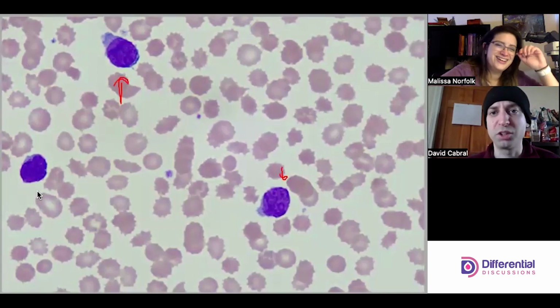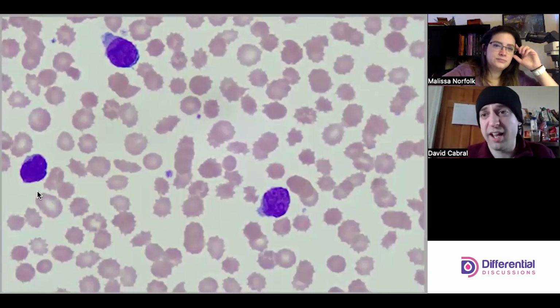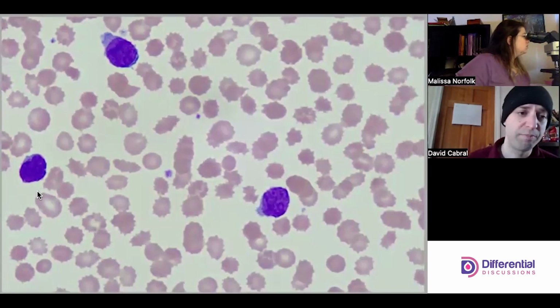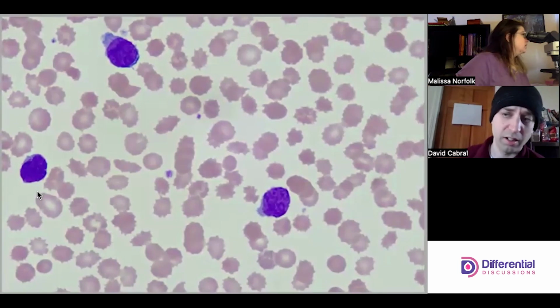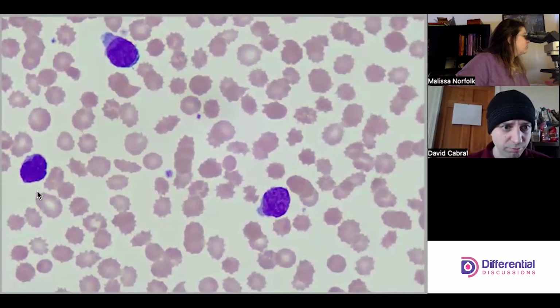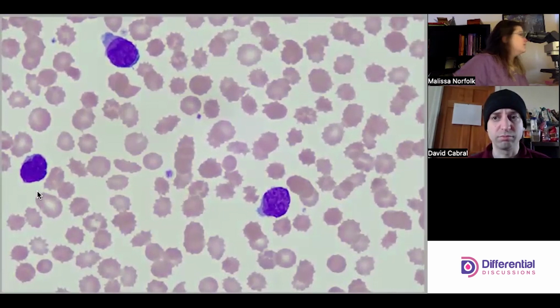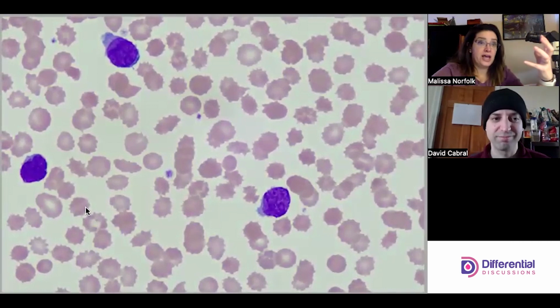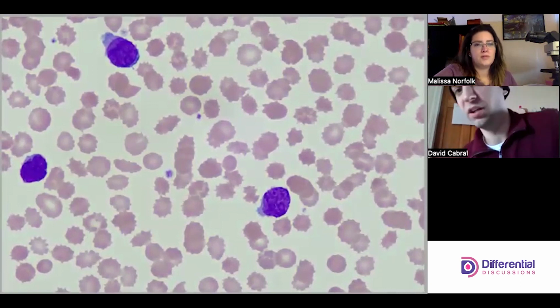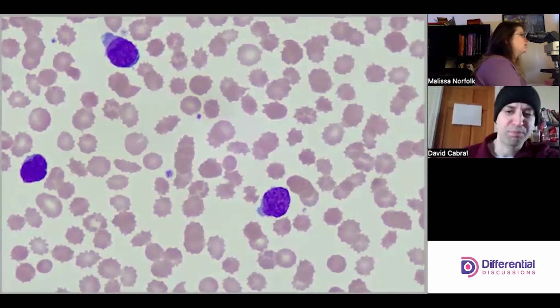Looks really, really dark and looks like there's a lot of heterochromatin possibly there. I'm not sure how you see it on your end. Trying to see if there's a nucleoli. That's what I'm looking for too. There might be, but it's not quite as prominent, or it looks more remnanty to me. It looks like there's a thing here, but it doesn't look like a nucleoli. Right, so I'm in the same boat. So I might go more on lymph on this one and just move on. Agreed. All right.